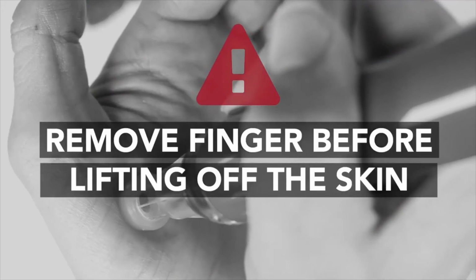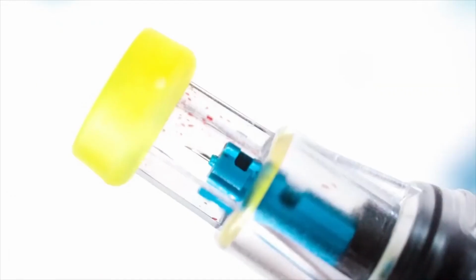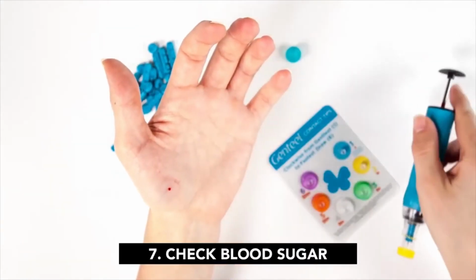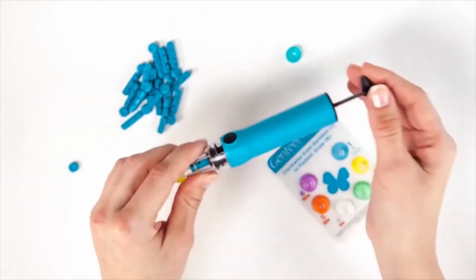If you remove Genteel before releasing the activation button, it will splatter the blood drop within the nozzle and there will not be sufficient blood for testing. After removing your finger from the activation button, you can now lift Genteel off your skin. Your drop of test blood is ready.